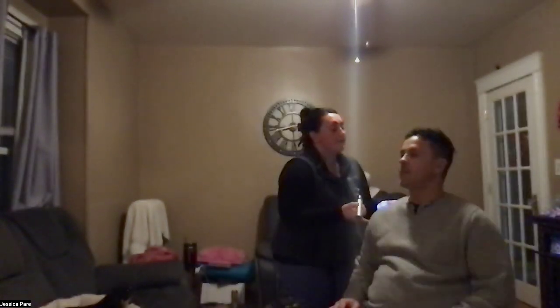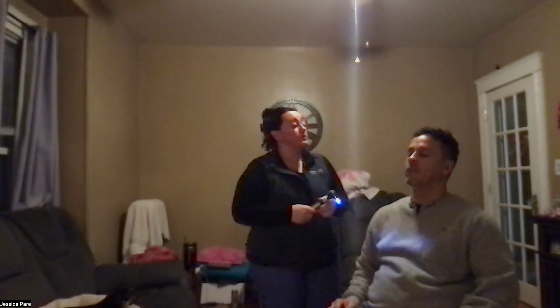The next thing I'm going to do is visualize the ear canal with my otoscope exam. So I'm going to pull the auricle up and back. Perfect. I see the tympanic membrane. It is pearly white. There is no bulging or redness noted. There is no cerumen. There are no lesions or drainage noted. I'm going to check the other ear.